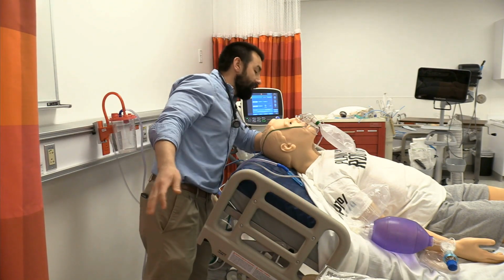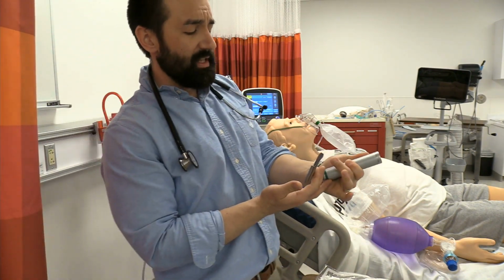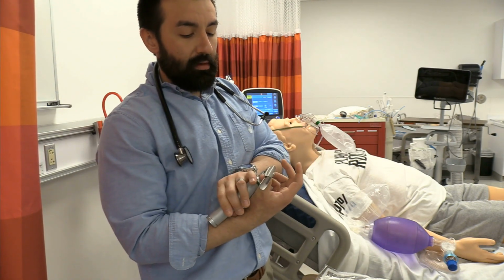The other stuff that I got set up and ready for the doctor, usually we'd ask the physician what they would want as far as being able to visualize the cords.